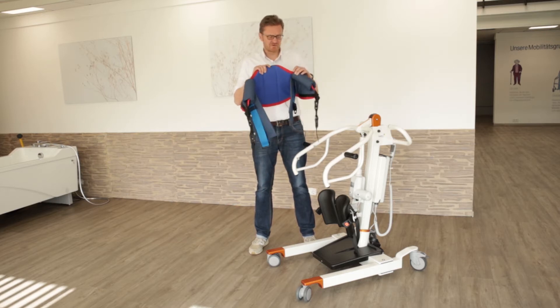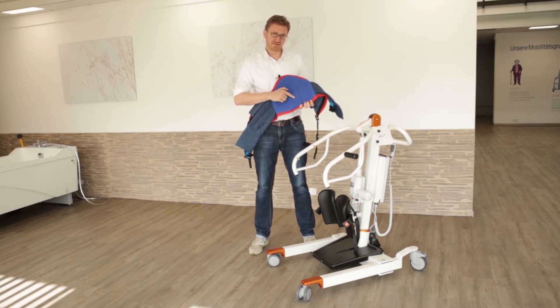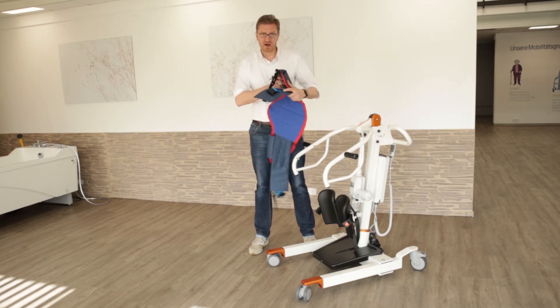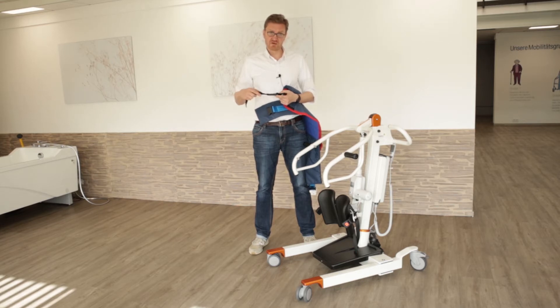Our Nora Sling comes in different sizes and it is specially provided with an anti-slippery surface on the inside to prevent the patient from slipping inside the sling. It has upholstery under your armpits to give you a comfort feeling in the uplifting movement. And it has our clip system in two different positions, which I will show you later.